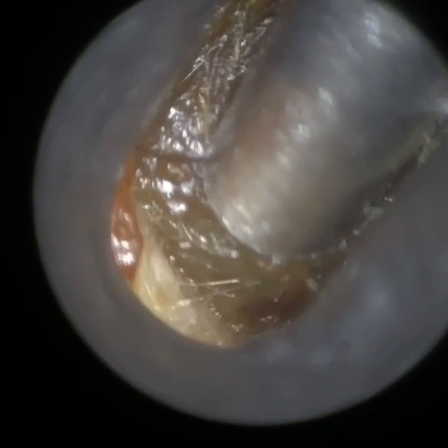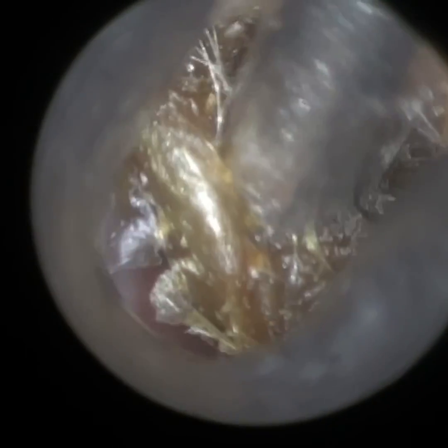Thank you for joining me in another demonstration video of our recently developed Waxscope. The Waxscope is due to be launched in the next four to six weeks tentatively, but we're working hard with the manufacturing and all the other regulatory items that go with a medical device.